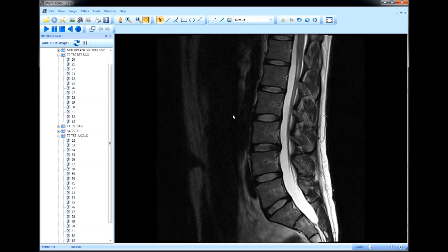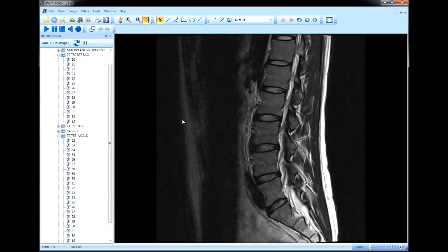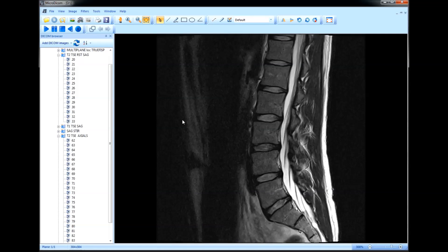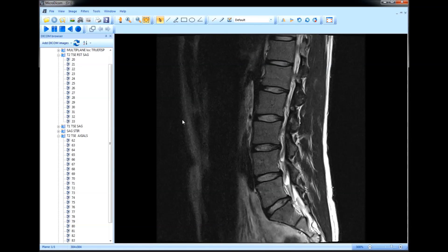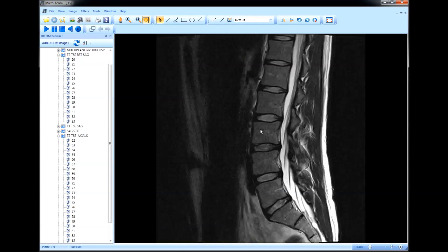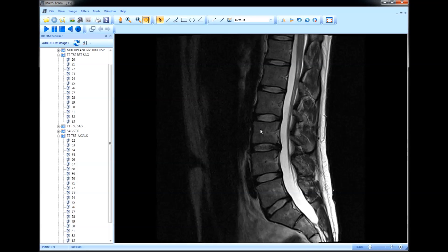Before we start looking at the intervertebral discs, I'd like to talk a bit about how to count vertebrae. Counting vertebrae is actually crucial to reading a lumbar MRI. When you read a report from your radiologist, they'll often comment on the level at which a particular problem occurs, and you have to know how to count vertebrae to understand what level they're referring to.